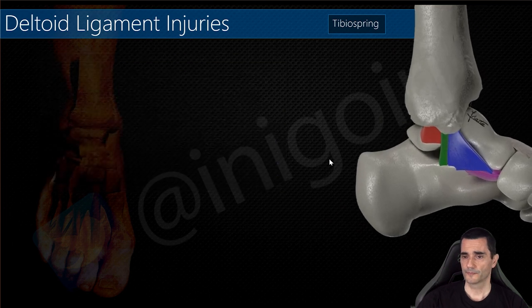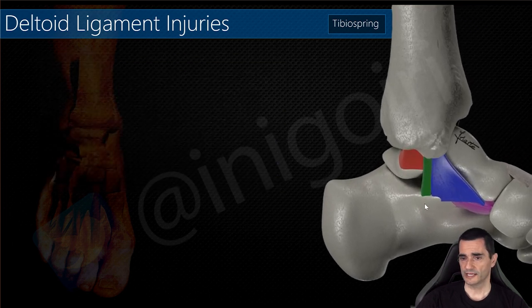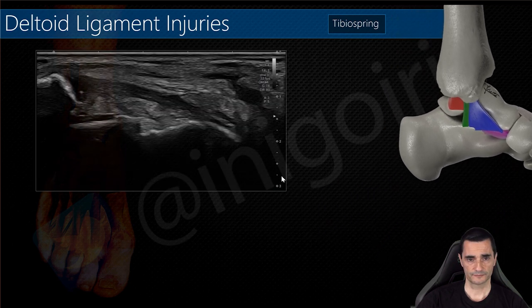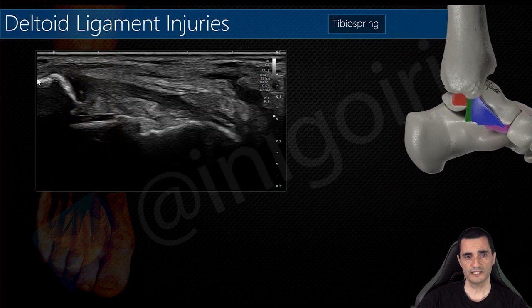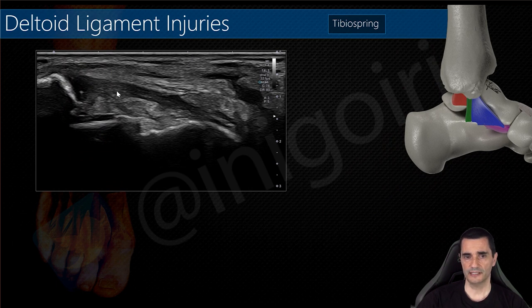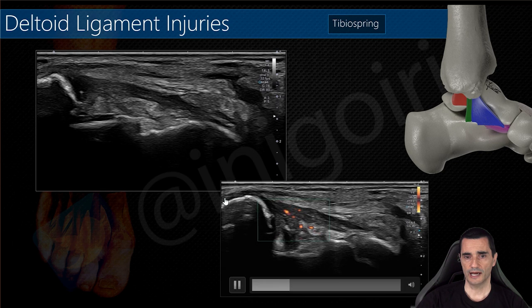We have seen the tibiocalcaneal component; now the tibiospring component between the tibia and the spring ligament. This is the tibiospring ligament on its short axis and you can notice here the thickening and hypoechogenicity of this component.